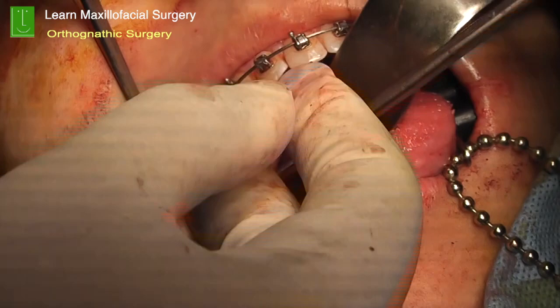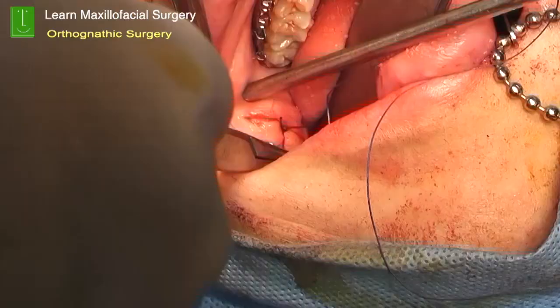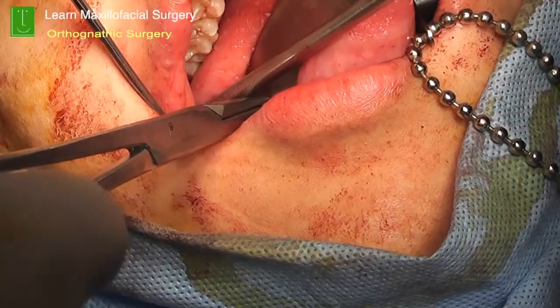I personally like to use either a 2-0 or a 3-0 Vicryl. I don't like to use silk, because silk you'll have to take it out after a week. Vicryl stays back for at least about a week to two, and that's good enough for the soft tissues to nicely heal before the resorbable suture material starts falling off.